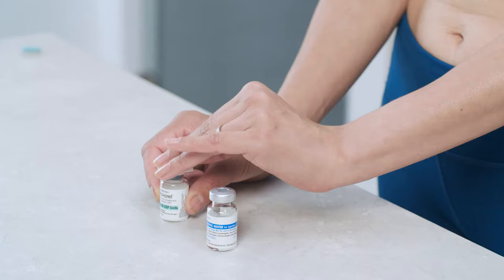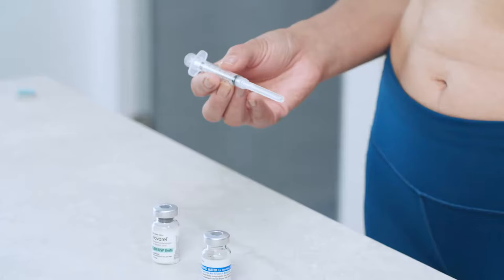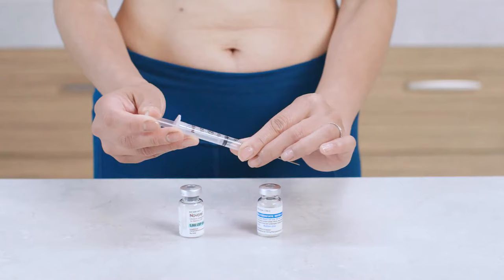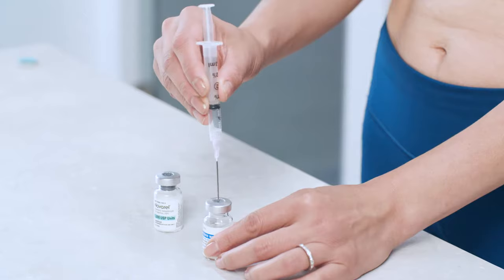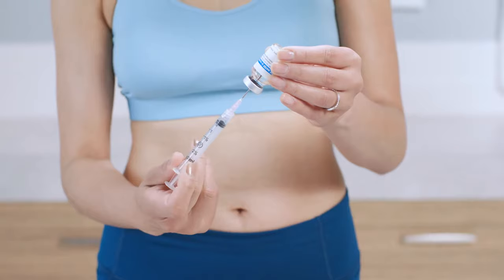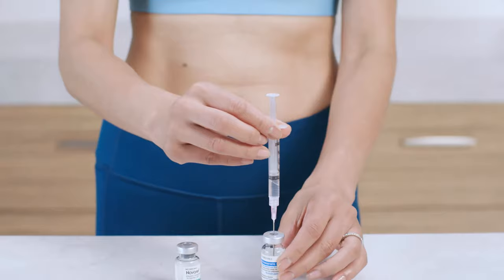To get started, remove the caps from both vials and wipe the tops of each with an alcohol swab. Unwrap the syringe — if there isn't a needle already attached, twist the mixing needle onto the syringe and remove the needle cap. Next, you'll draw air into the syringe, so pull back the plunger to the amount of diluent your healthcare provider has recommended, usually 1 CC or 1 ML. Place the vial on a flat surface and insert the needle through the rubber stopper and into the vial. Gently press the plunger all the way in, which pushes the air into the vial and makes it easier to withdraw. Then, without removing the needle, turn the vial upside down. Make sure the tip of the needle stays submerged in the solution as you slowly pull back the plunger to withdraw the recommended amount of diluent. When you're done, place the vial on a flat surface and withdraw the needle.